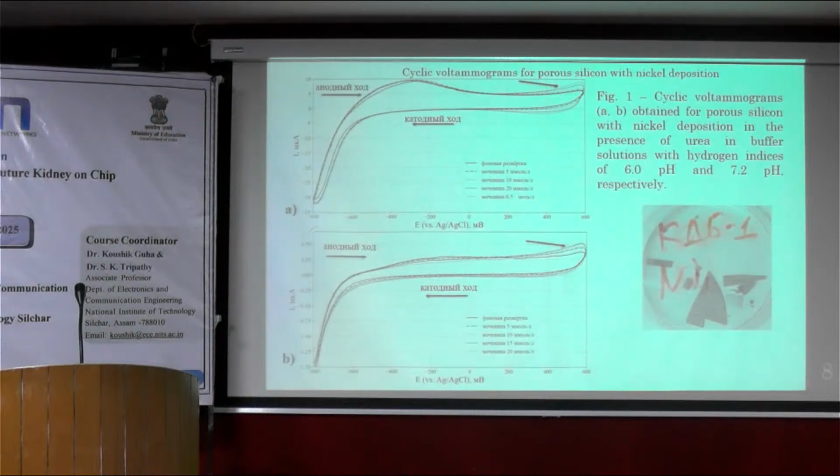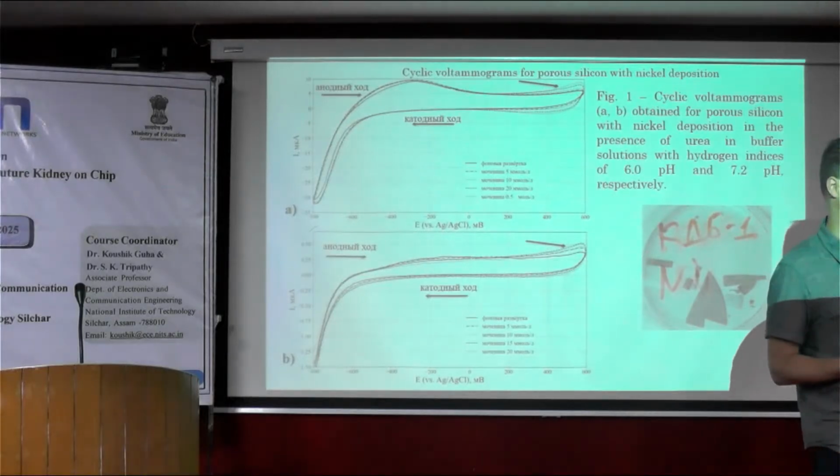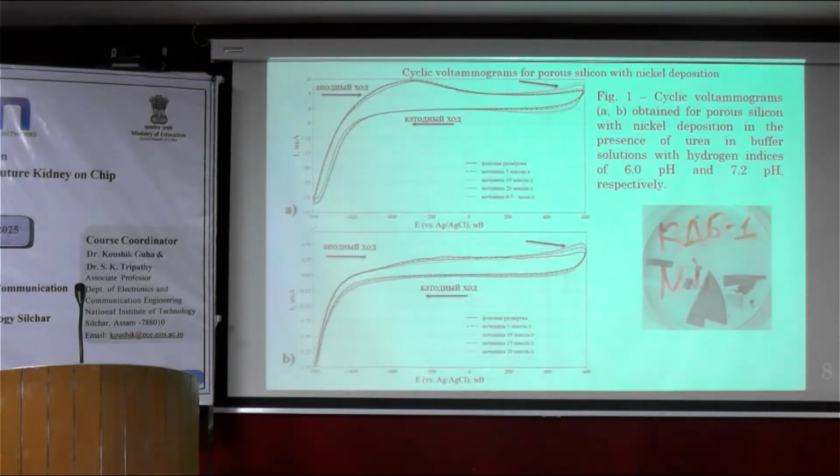And another problem here is the electrode degradation. So if we talk about the long-term exploitation of that system, we can expect that if we utilize this electrode for a very long time without any calibration whatsoever, the surface of the electrode will be changed due to chemical reactions that might happen at these potentials.